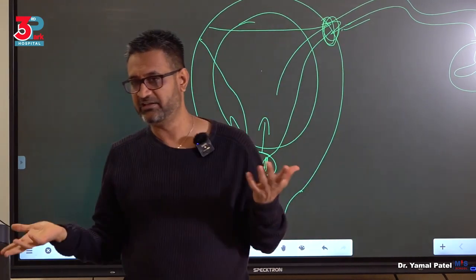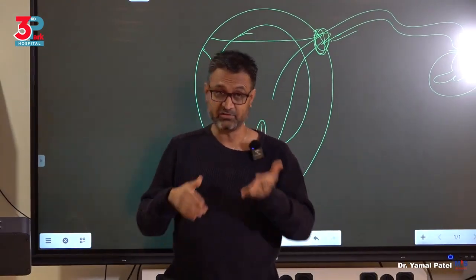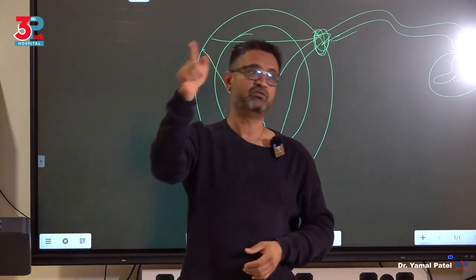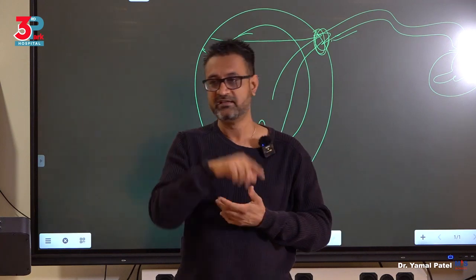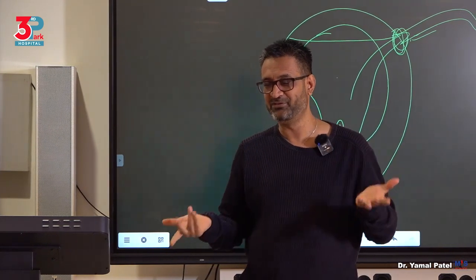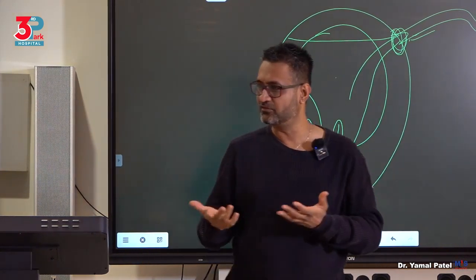So you're doing a vaginoscopy. And then you're seeing the cervix there. You see the anterior fornix. You see the lateral fornix. You see the posterior fornix. Then you go behind and see if there are any, like if I do endo, if there's any nodule on the posterior fornix, those sort of things.